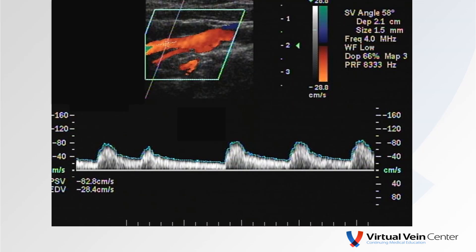One of the first things I need to do is make sure I accurately differentiate the internal from the external carotid artery. If I show you this image and ask whether it's from an internal or external carotid artery — I do see somewhat of a low resistance waveform, typical of the internal. However, look at the image — it does appear there's a branch off of there. So if I'm a betting man, I'm going to say this might be from the external because there's a branch off that vessel.